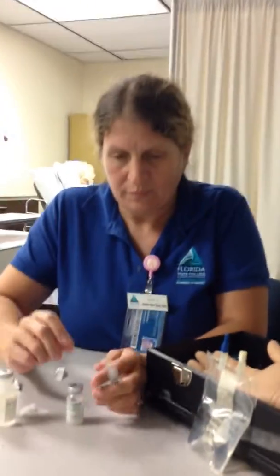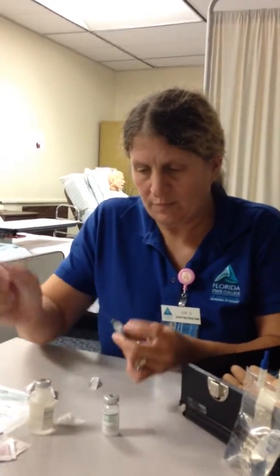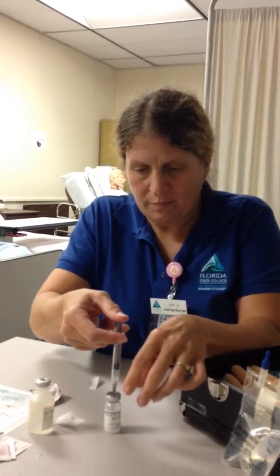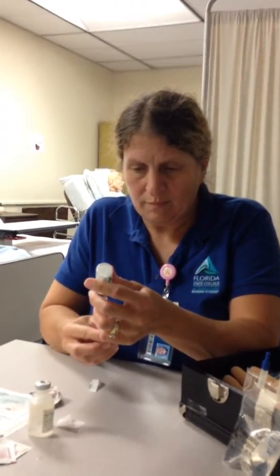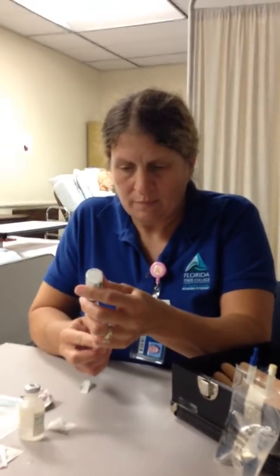This is a 100 milliliter bag. Again, I check my insertion site that there's no swelling or redness. I'm going to ask Mr. Miles if he's doing okay. I'm going to ask him if he has any headache or nausea, and I'm going to come back in 10 to 15 minutes to double check on him, and I am going to document. This is completely sterile.